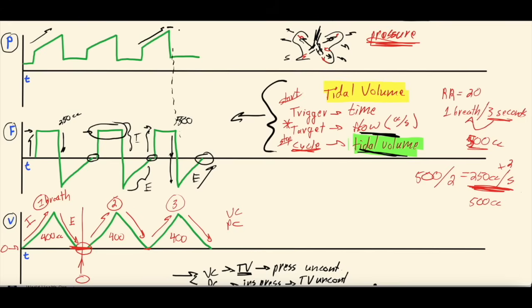Breath is done, at which point the patient exhales and the pressure drops back down to this set pressure, which, if you watched our original video, is the PEEP, the positive end expiratory pressure, which we won't go into here. Definitely check out that other video. And as you'll see, and we're going to link all these in the video description, when we talk about pressure control scalars, this looks different than a pressure control scalar.